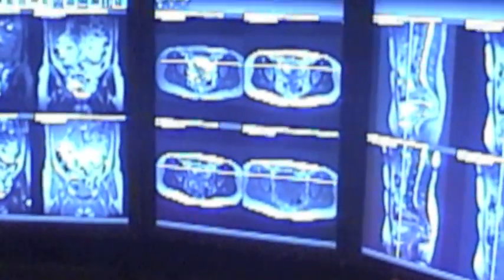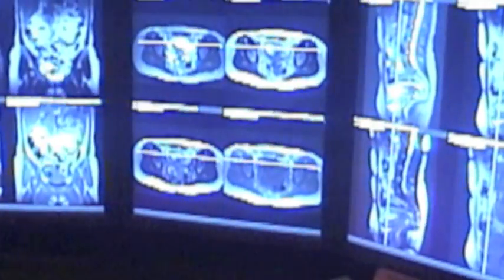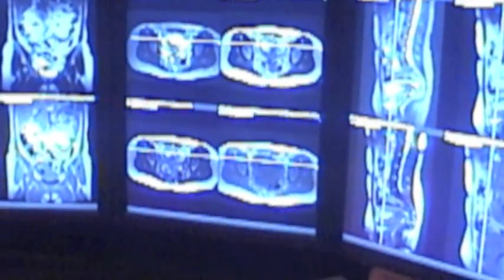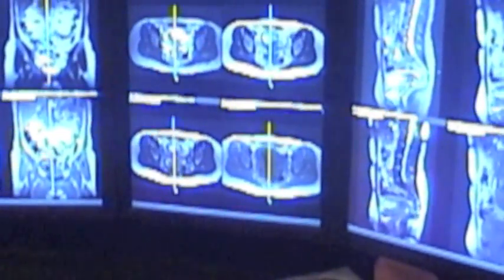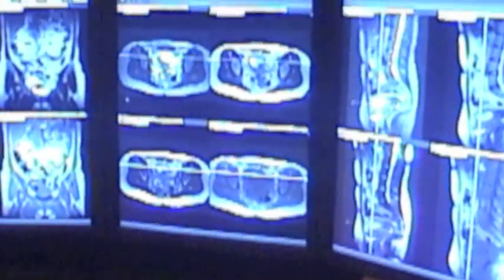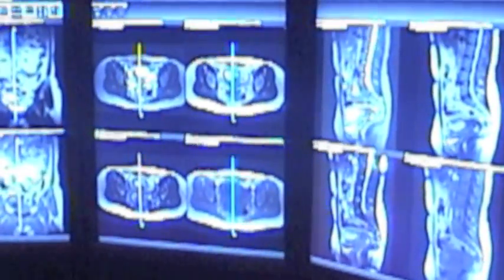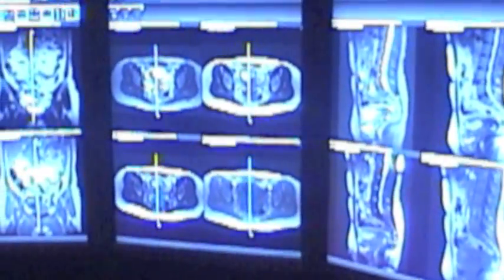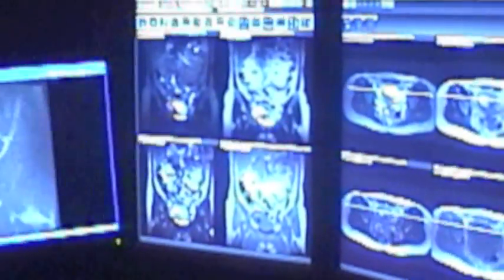We acquire those four sequences — Haste IR, Haste, True FISP, and IO Flash T1s — in three orthogonal planes: coronal, axial, and sagittal, and set them up on three monitors. The diffusion I open up independently, placing the coronal diffusion on the left monitor as a large field of view.